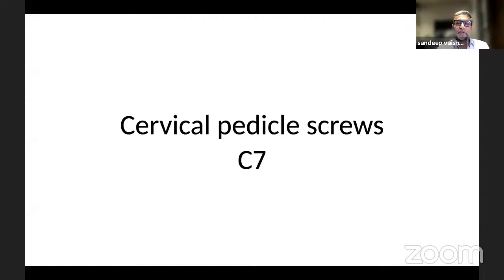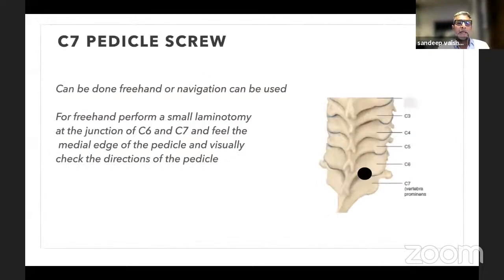Now a brief about cervical pedicle screws. So I'll start with C7 pedicle screws, which we do often. It can be done either freehand or navigation can be used. I do both. Many times I do freehand, but if the pedicle size is small, sometimes I use navigation also.